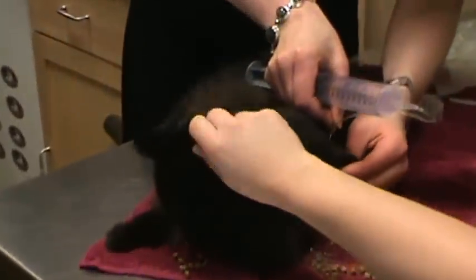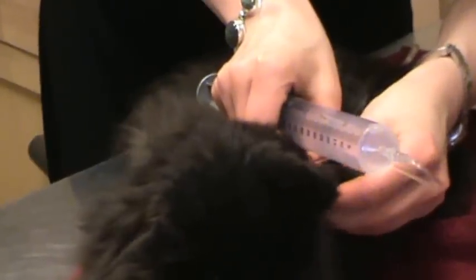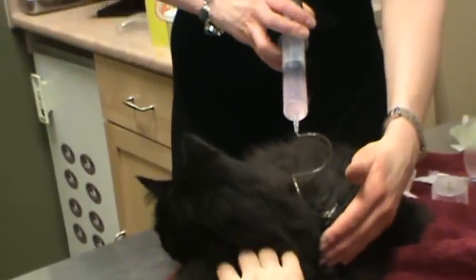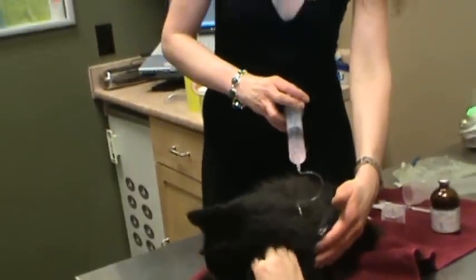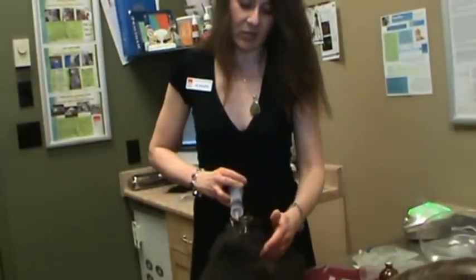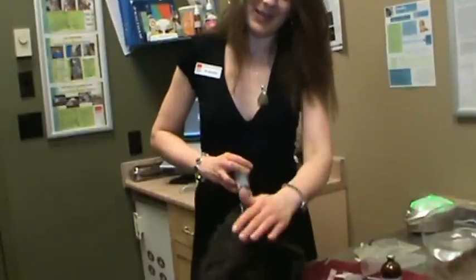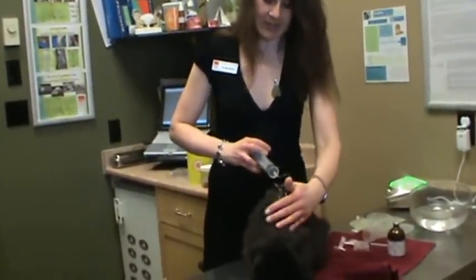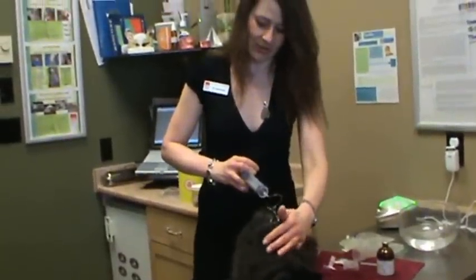I pet him nicely and he's doing so well — he's such a good cat. A lot of times I'll have clients put their cat in a laundry basket and work with them that way, or in their cat carrier — you can take the lid of the cat carrier off and easily keep them secure in there. They feel comfortable in there. I think cats feel good when they are receiving the fluid, like when we're dehydrated and have heat stroke we feel really uncomfortable, but once we get a good glass of water we feel so much better. Shaka is really enjoying eating his treats and getting petting at the same time as receiving his fluids and his vitamin B injection. The vitamin B is usually a once-a-week injection so you don't have to do that every day.